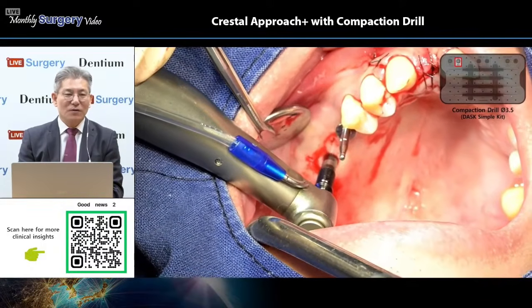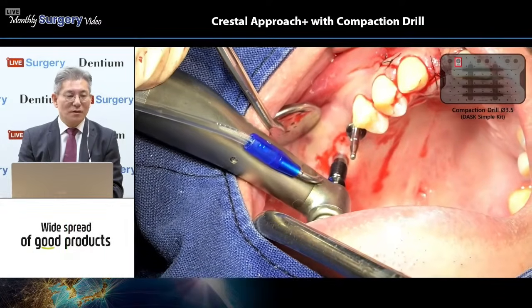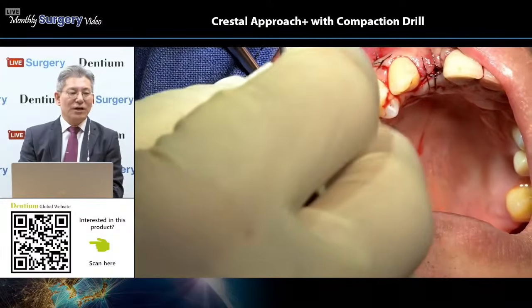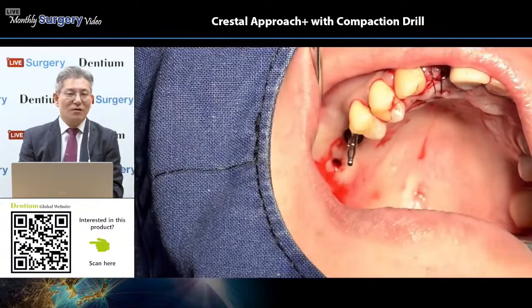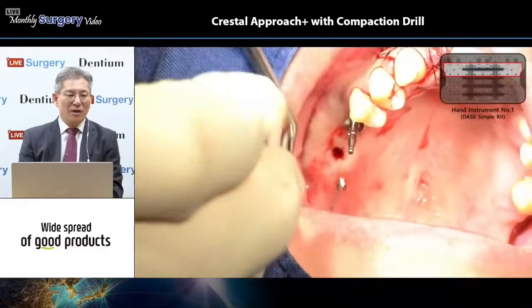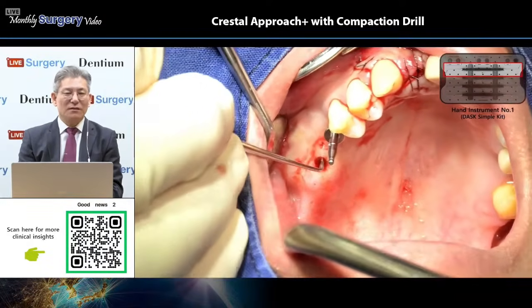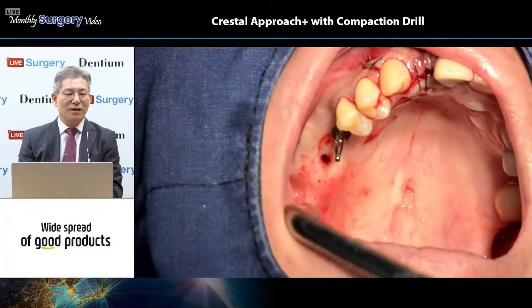It means the sinus floor, the grinding, the sinus floor perforating, right? And after that, we drop out the drill and check with the depth gauge whether the membrane is intact or not. There's actually a little bit of resistance inside of the cavity. It means intact membrane. However, without any resistance means suspected. We can suspect the perforated membrane. Okay, and after that, checking the intact membrane.